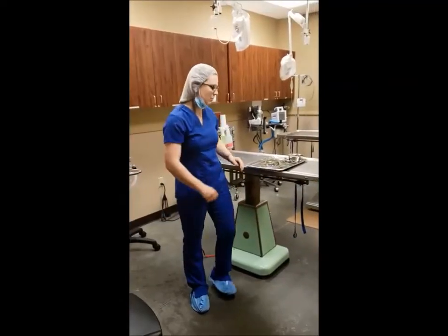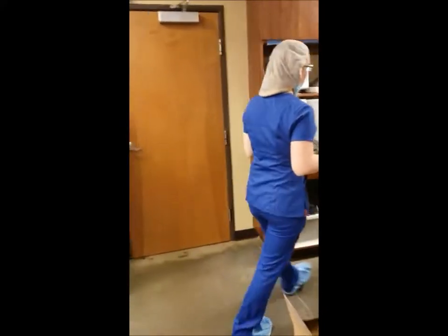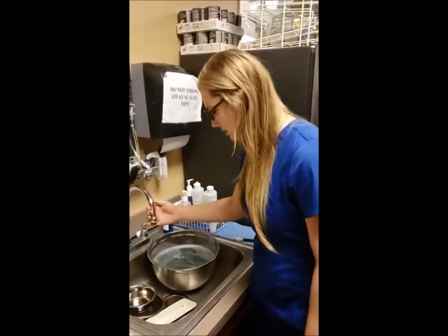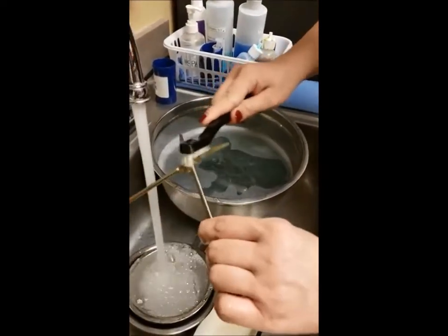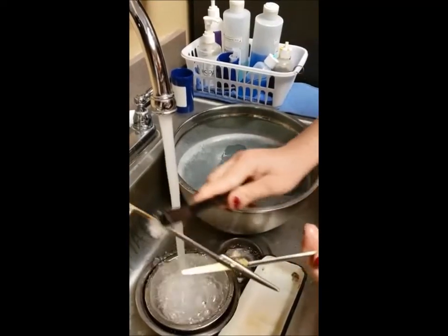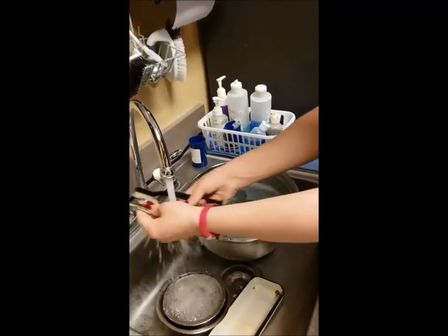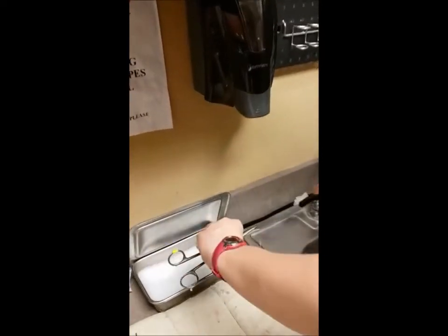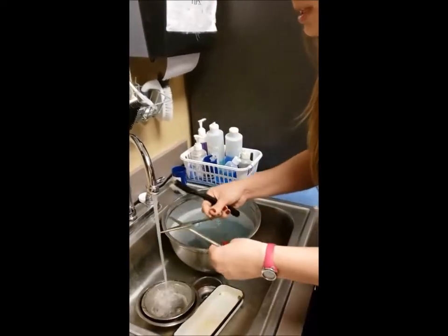Okay, now that our surgery suite is clean, I will take our instruments and I will go wash them. We soak our instruments in Chlorhex solution and water. Okay, I'll go ahead and wash some of our instruments. So, it's important to knock all of the blood off of these instruments because our autoclaves will not do that for us. So, the reason why we scrub them is so that we can make sure that we get all of the blood off. And I scrub the handles too because sometimes blood can get on the handles. And rinse it off, make sure, inspect it. And then we put it in instrument milk, and that is going to lubricate the joints of the instrument. And that's just going to make sure that it opens and closes easier.